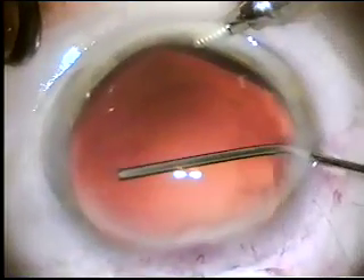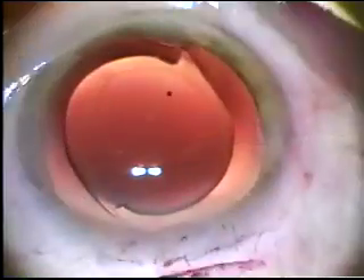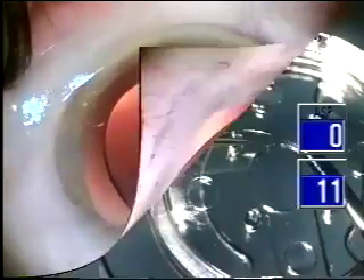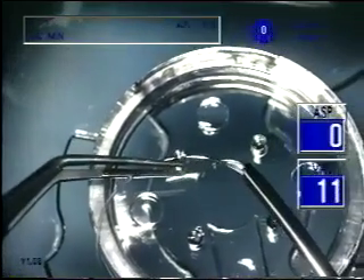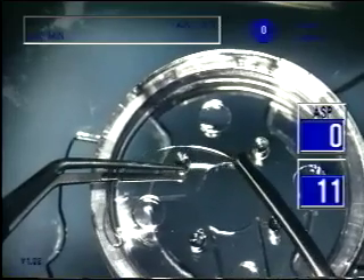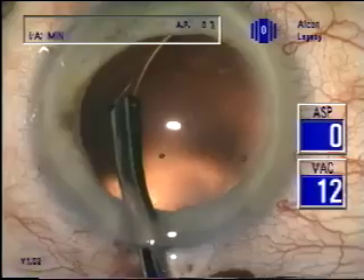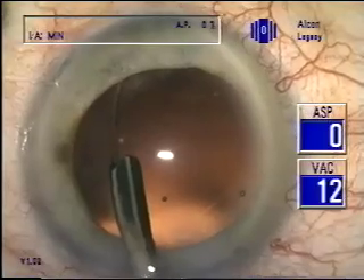The capsular bag is expanded with viscoelastic, the lens is placed, and you can note it centers perfectly. One manufacturer supplies an injector for the endocapsular tension ring. The loop is grasped with a hook that is pulled back into the cannula, threading the loop into the cannula for easy insertion into the eye by simply expressing it and letting it snake around the capsular bag.